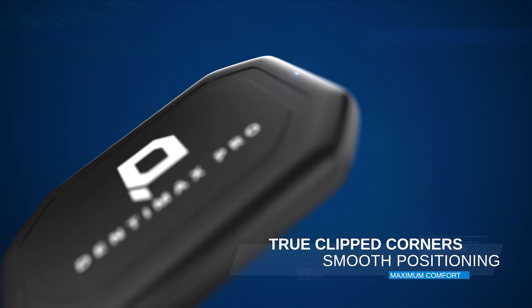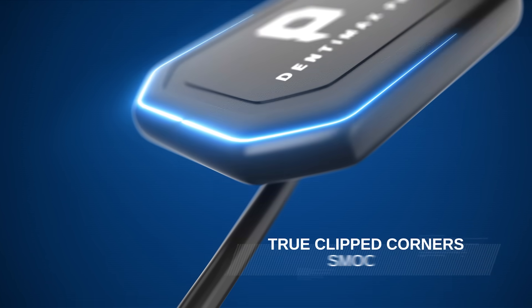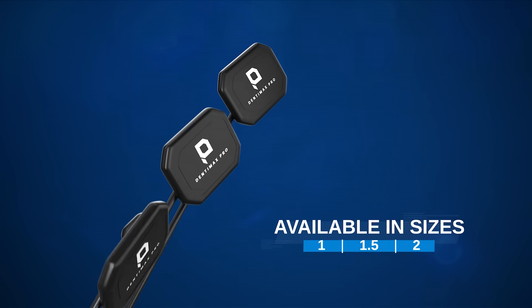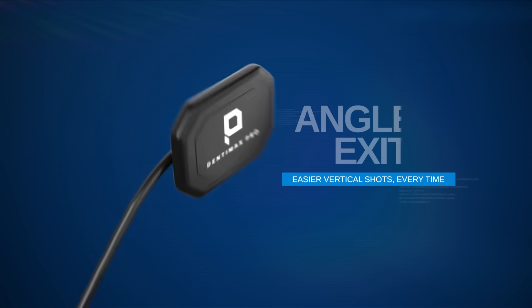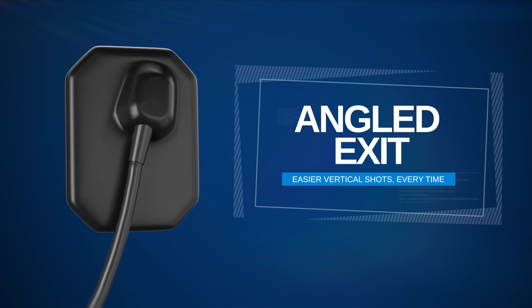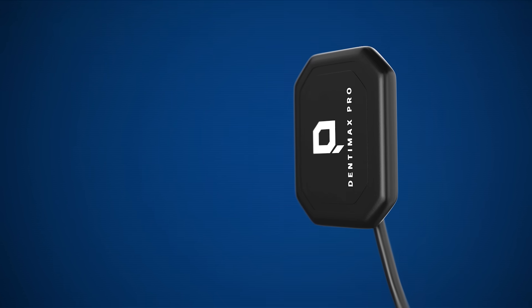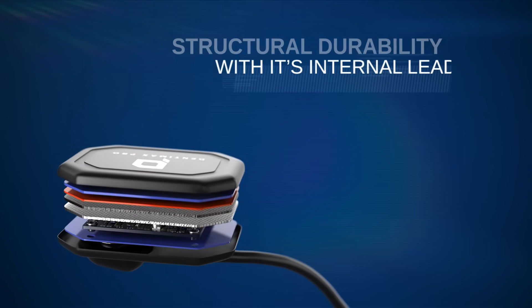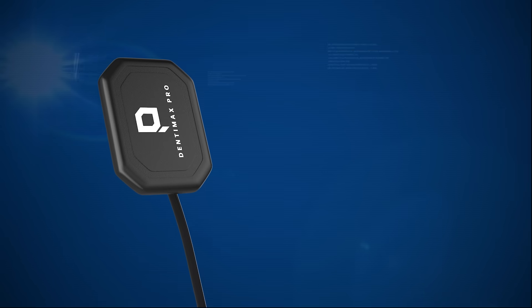True clipped corners and beveled edges ensure smooth positioning and enhance patient comfort. Available in three sizes: 1, 1.5, and 2. Our Kevlar-reinforced 45-degree cable exit makes vertical bite wings easier while improving cable longevity. Engineered with bite-resistant housing and anti-delamination construction for years of reliable use.